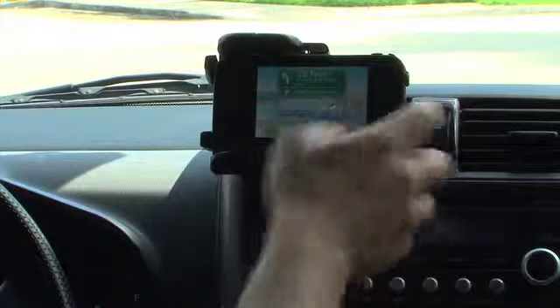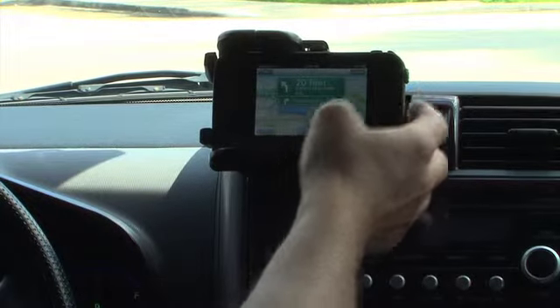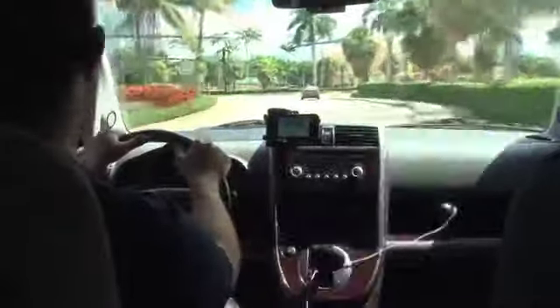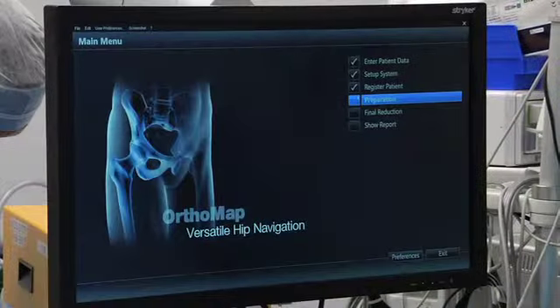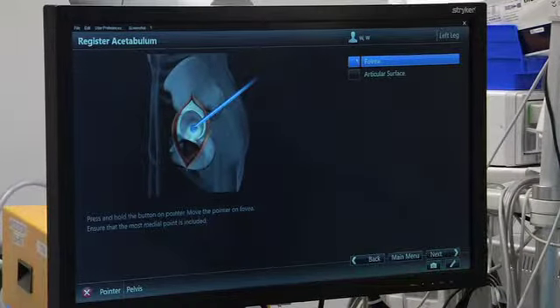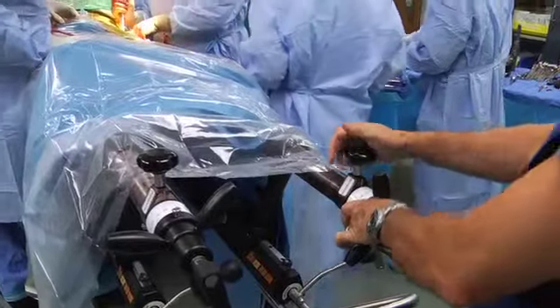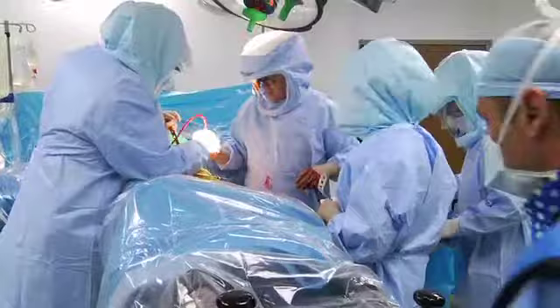At some point, most of us have used GPS technology to get us from point A to point B. Turn by turn, we can be guided to go just about anywhere we want to go, even in the operating room. You heard right. Navigation technology for very common procedures like hip replacements is being used in ORs across the country, and the benefits far outweigh the risks.